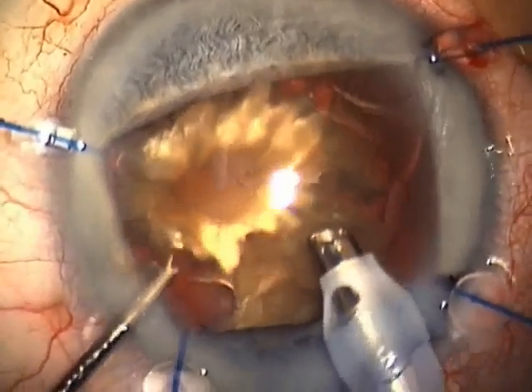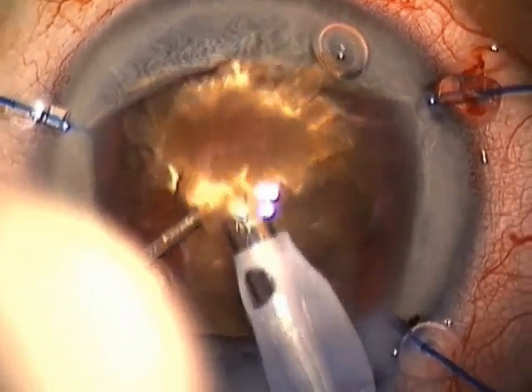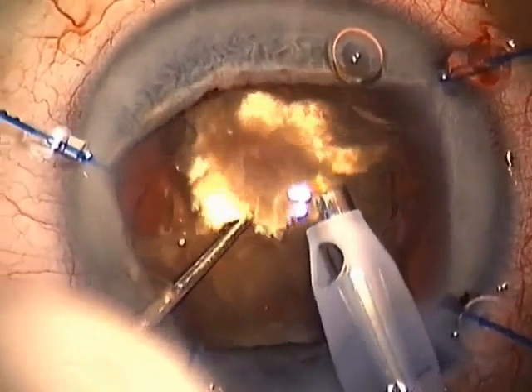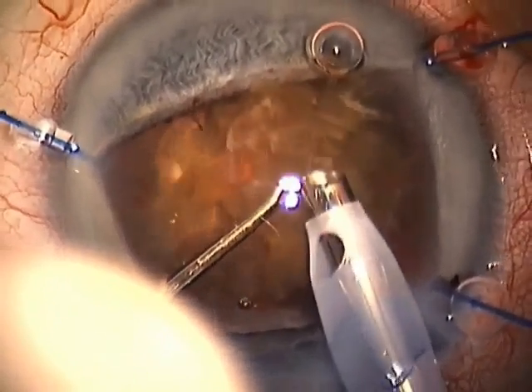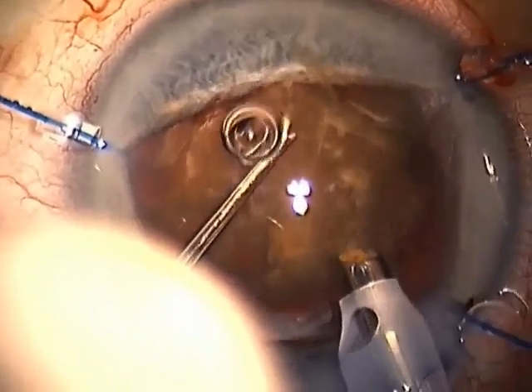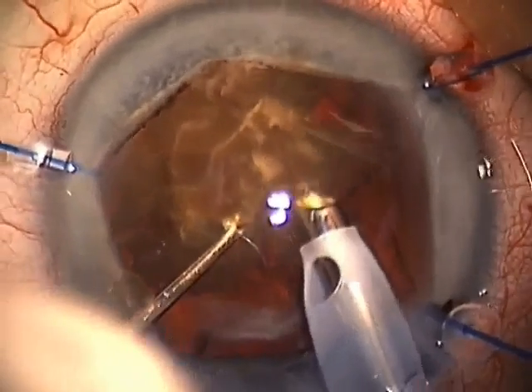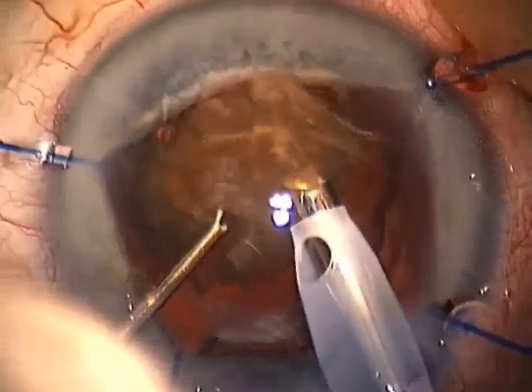While the Millennium was absolutely superb, the Stellaris is even better. This is another dense lens — a patient on Flomax. We're using clips, and you can see the great control we have. When doing these very dense lenses, the key thing is controlling the nucleus. I do FACO flip — we eat the lens kind of like an apple.